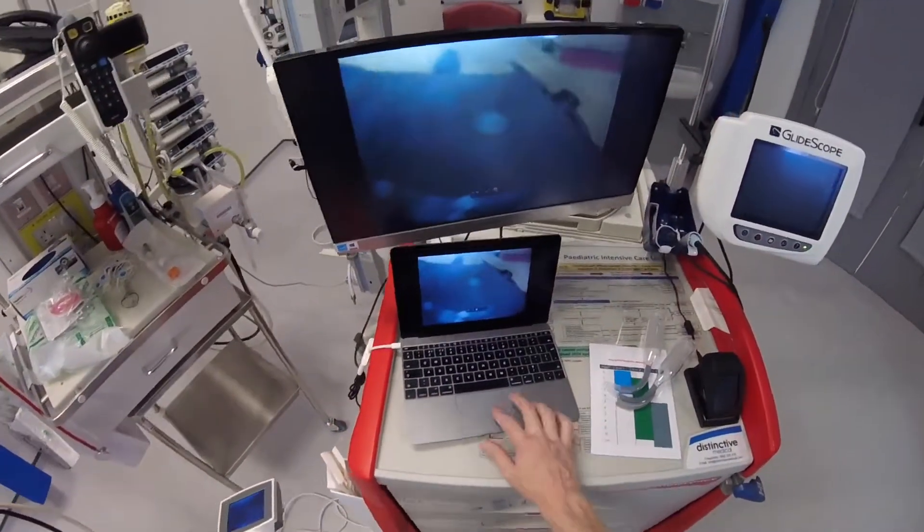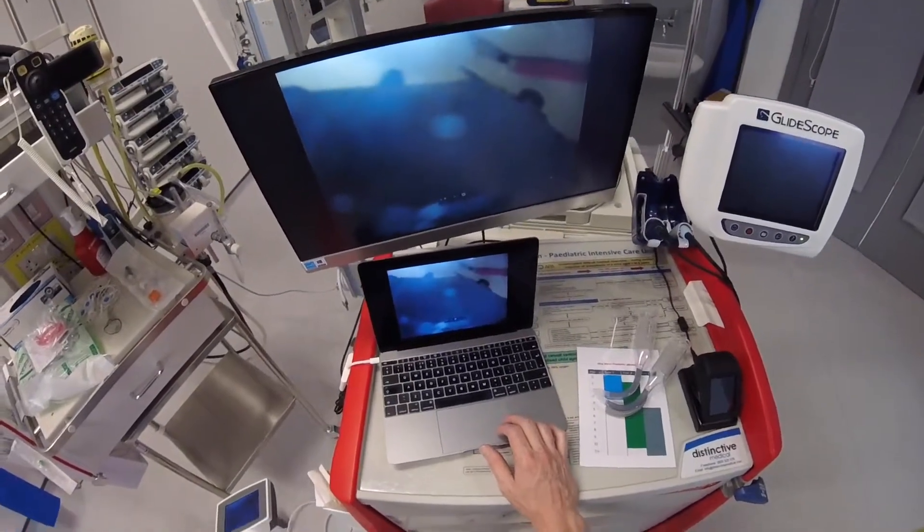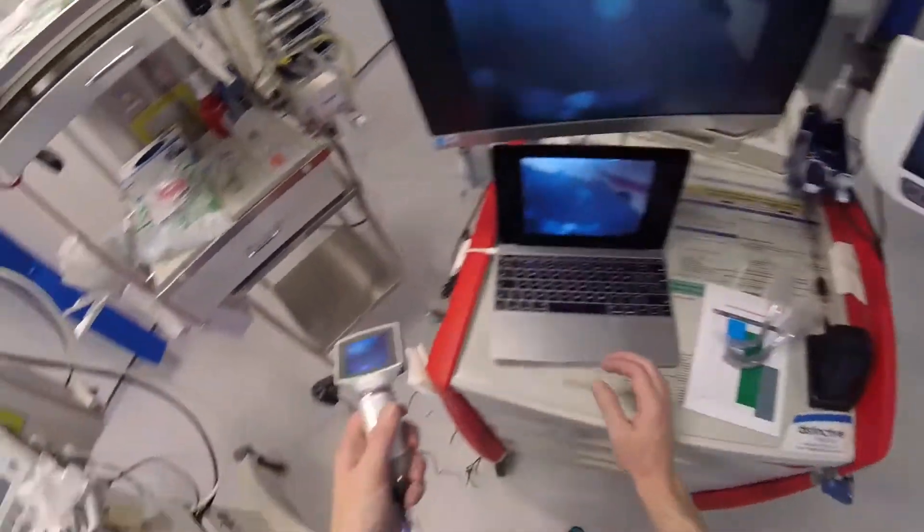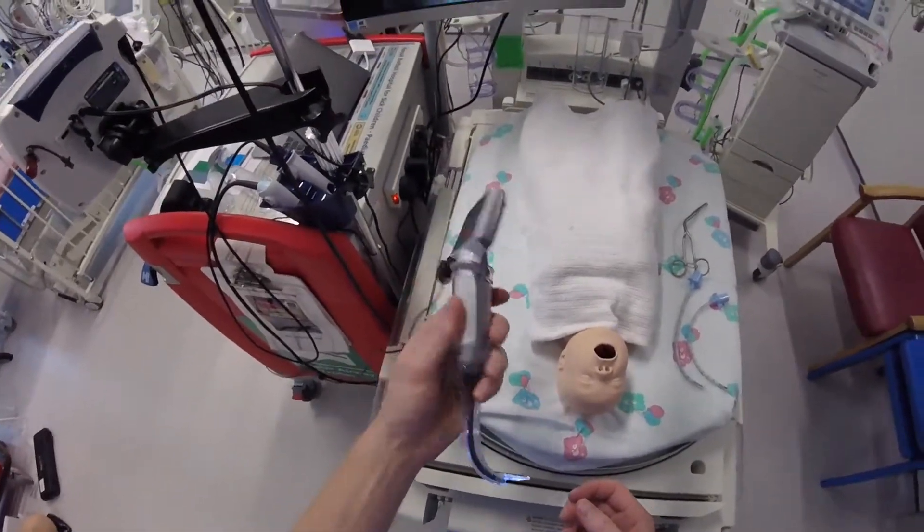If you're using a PC, there's probably similar software that you can use. So I want to show you this on the mannequins now and give you a quick run through of how to actually use this.